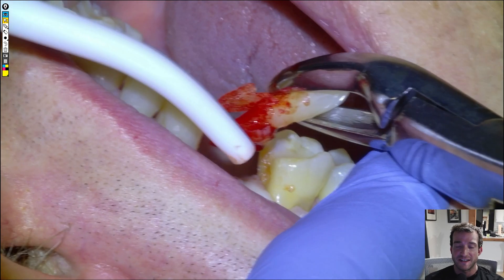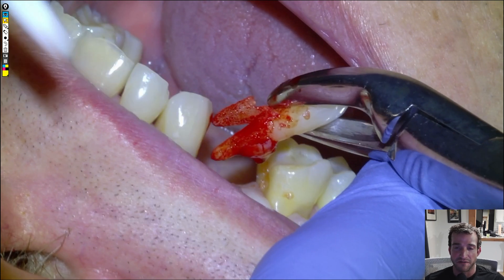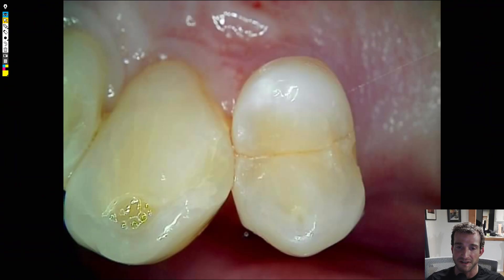Hey guys, Dr. Dobson here. This is a fun extraction that we did for a tennis buddy of mine, Peter. Every once in a while he'll call me with a dental problem and I'll usually get him in same day. Fun fact: my most watched video is actually an extraction for a crazy abscessed lower left molar. But this is a tooth that he said all of a sudden hurt like hell to bite on.